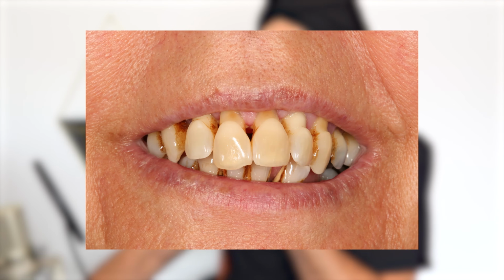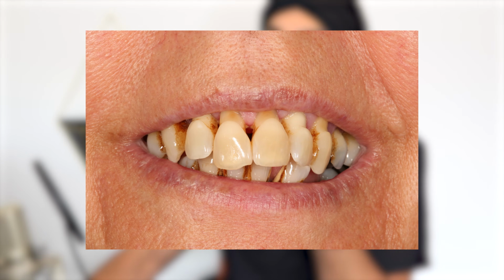Okay, we're going to make these dentures, and with the look of these dentures, we're not having an opportunity to try them in and make modifications. We have to commit. So there is some guesswork involved here. So that's my incisal length. The next thing I try and judge is how much overlap.